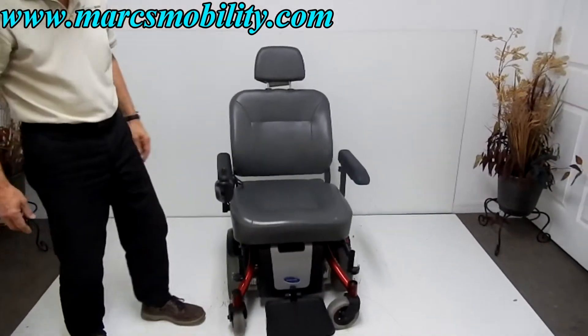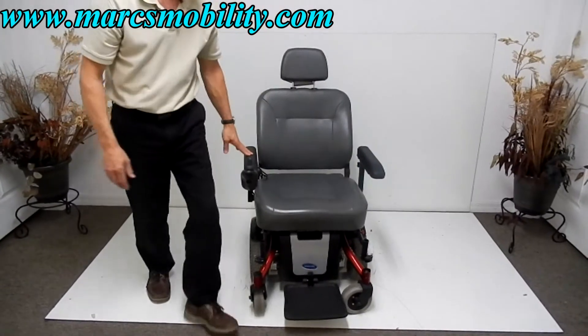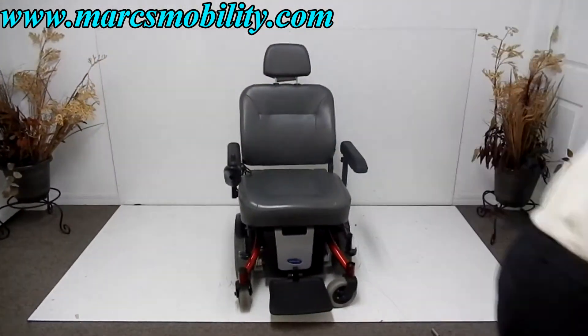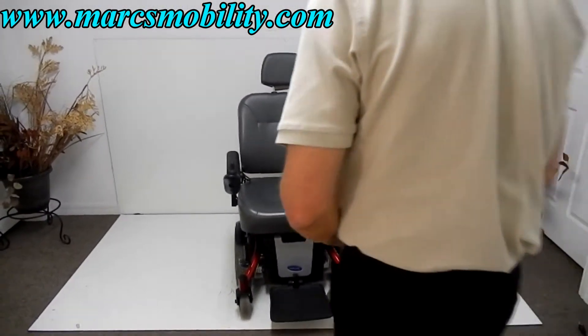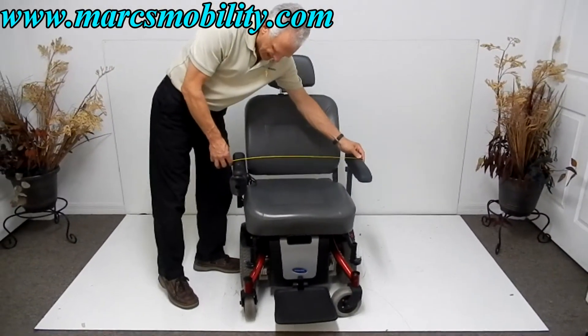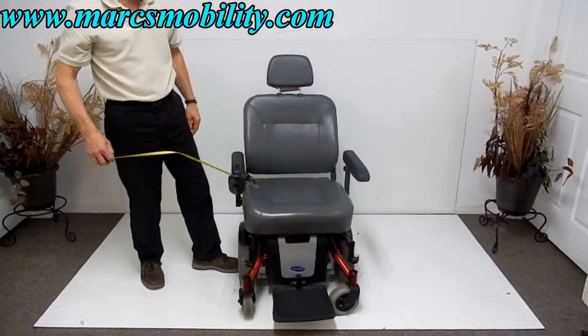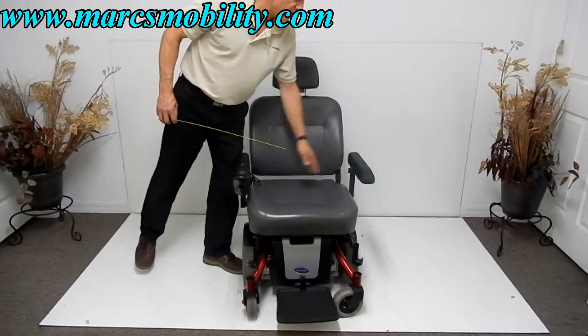The width of this chair is about 25 inches from side to side. The arms, from one side to the other, are 26 and a half inches outside to outside — so the arms are a little bit wider than the wheels.